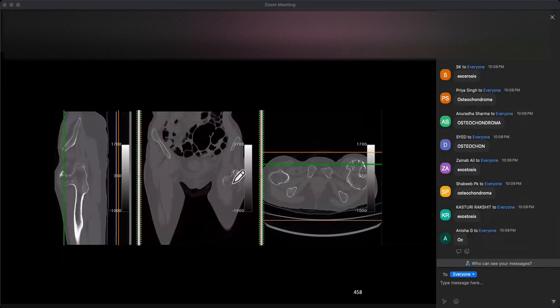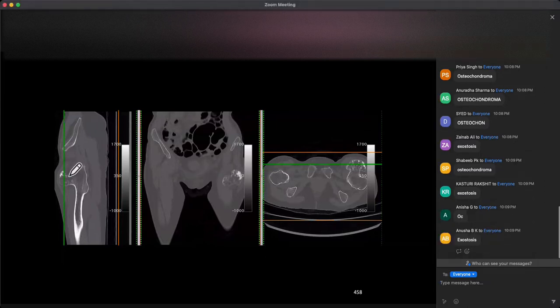Looks a bit like a cauliflower, and it's a bony exostosis that arises, in this particular case, from the anterior cortex of the proximal left femur. And what you can't see on CT particularly well is the cartilage cap, and you may need to do an MRI scan to have a look at that. But before you do an MRI scan, look at previous films, because the previous film would be really useful in determining how it's changed from one film to another.